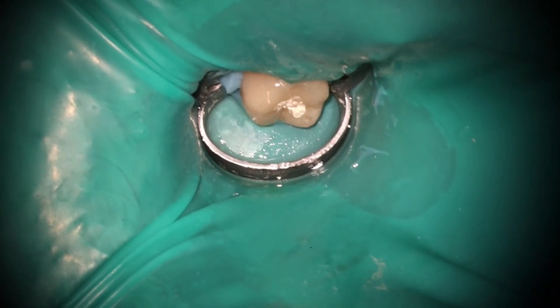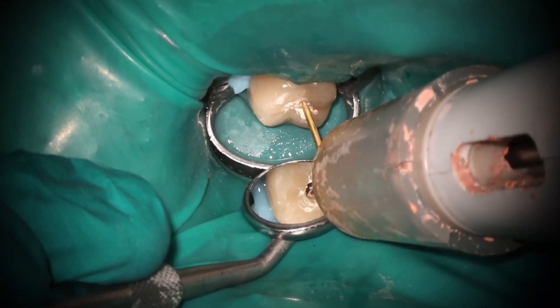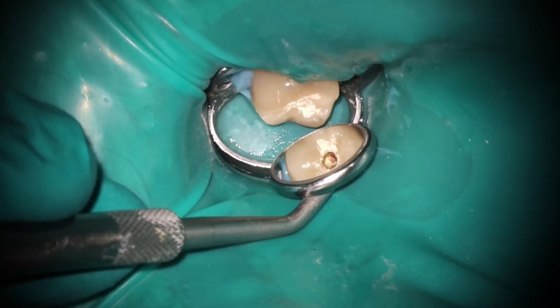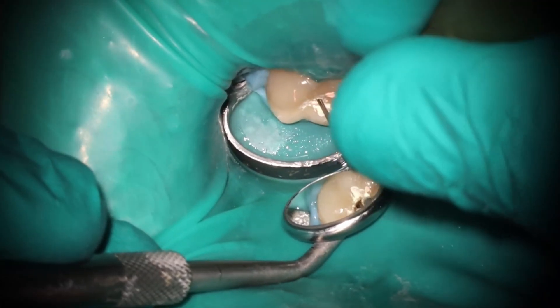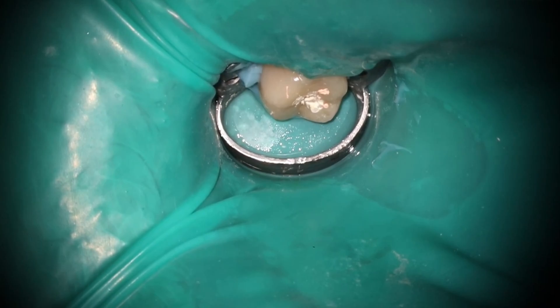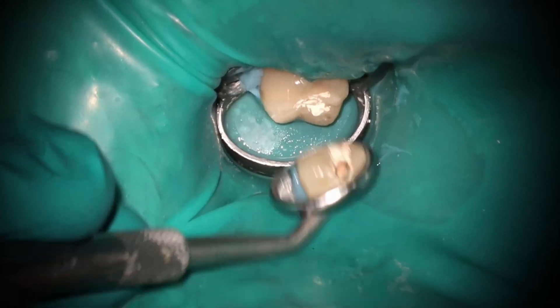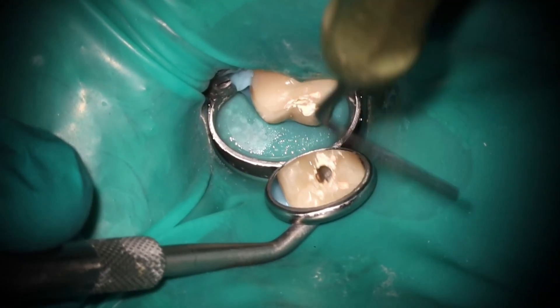You'll find even on cases where it's really calcified, or if you've struggled getting rotary files down, oftentimes the GentleWave will remove enough debris that you can actually get the file to go to length pretty straightforwardly. I've been using this for about a year and a half at another office and really enjoyed it. As far as the squirt technique, there's really not too much difference as far as obturating a GentleWave case versus a traditional case.